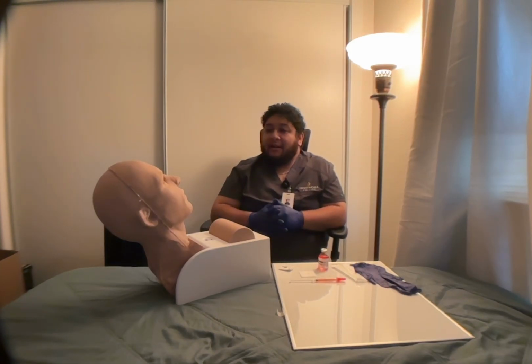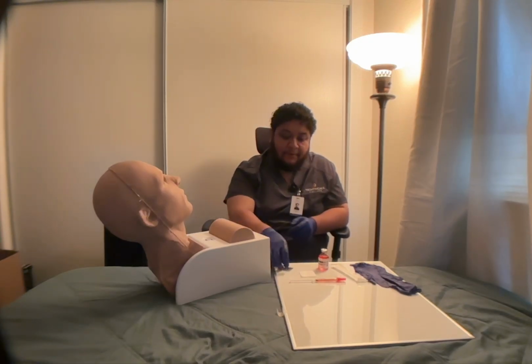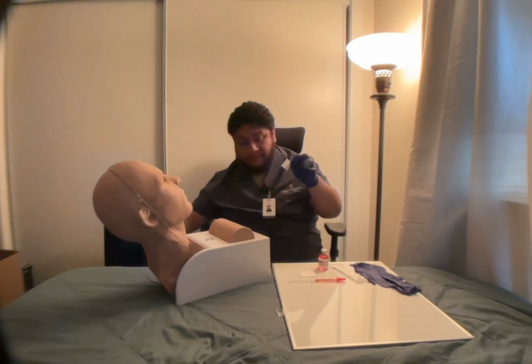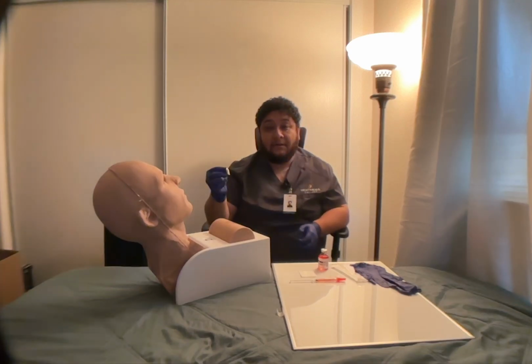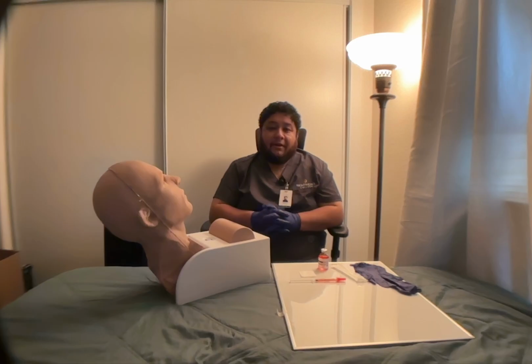Mr. John, thank you for allowing me to assess your abdomen. Everything looks good, and we're now going to go ahead and proceed. Now I'm going to go ahead and clean the site with an alcohol swab. Right here, discarded my trash. Now I'm going to go ahead and start inward and work my way outward 2 inches. Like so. Discarded the alcohol swab. Okay, so I'm gonna let my area dry completely. I'm not gonna touch the area.